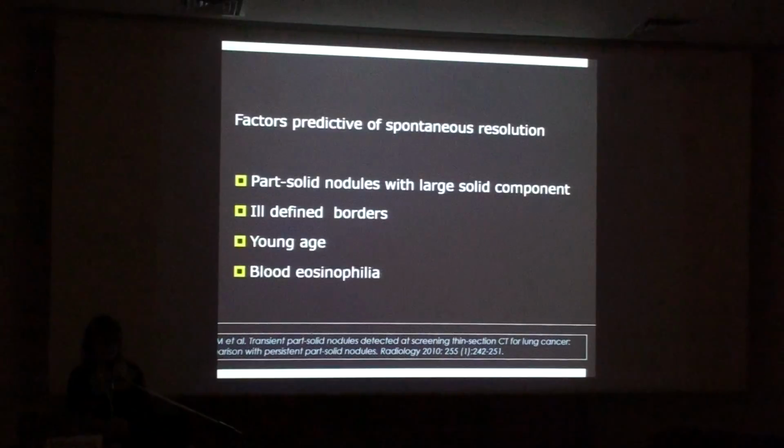It's true that if you have a pure ground glass lesion, you should not interrupt follow-up. And so it's quite a decision in a 50-year-old person to decide that each year for 10, 20, 30 years, the person is going to have a follow-up CT.